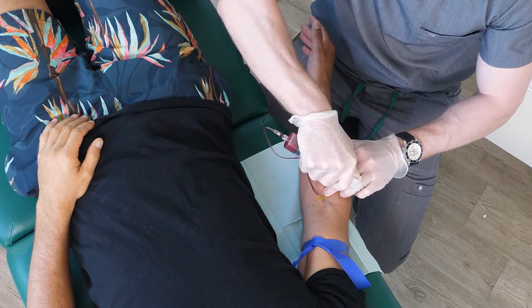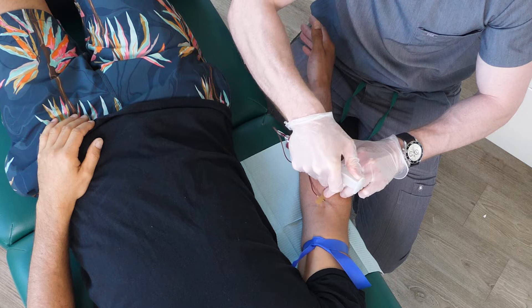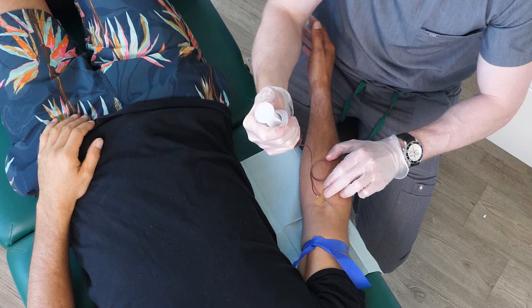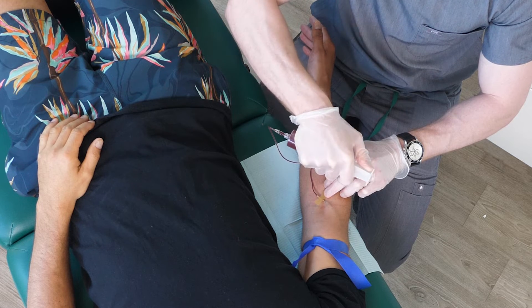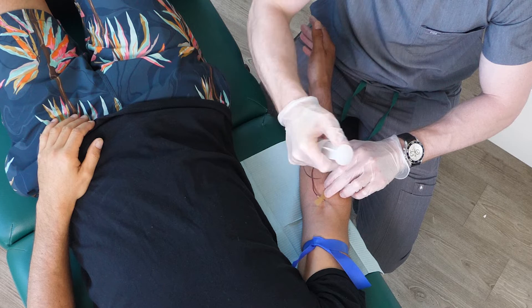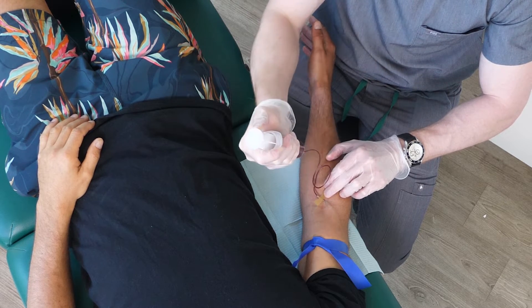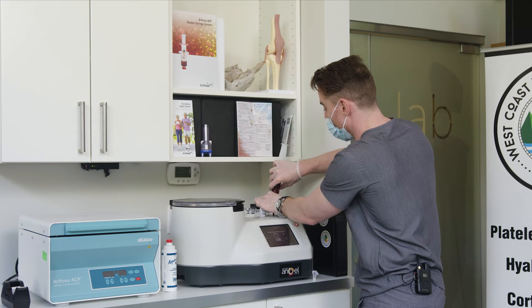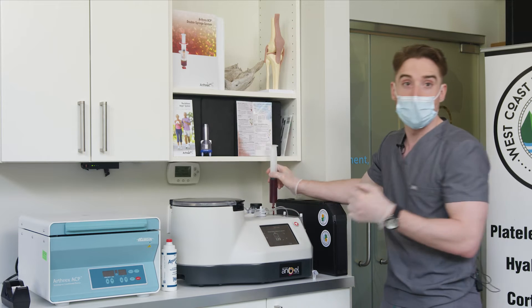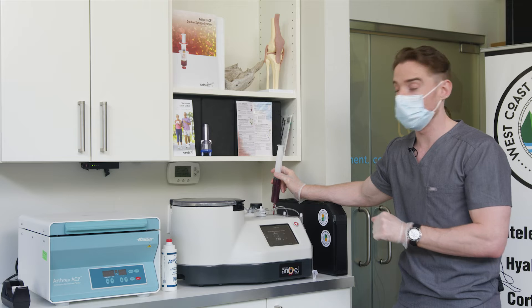So we're collecting the blood and we don't want to be collecting this too fast from Jaden. We want to be very gentle with these platelets, as if we're too aggressive with shaking, they can rupture. Here we are adding the second syringe of two to the Arthrex Angel PRP system. We've collected a total of 120 ml of fluid for the PRP system.